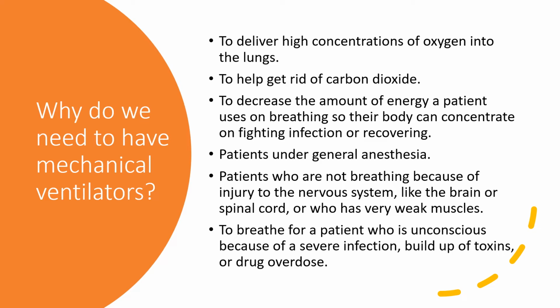So mechanical ventilation is life-saving. It can really make a difference for so many patients. There are some people who use mechanical ventilation for a short period of time just to get over whatever medical ailment they have. And then there are people, like I said, with neuromuscular disease who are on mechanical ventilation for life. So mechanical ventilation is a very, very important tool, and how you use it is even more important.